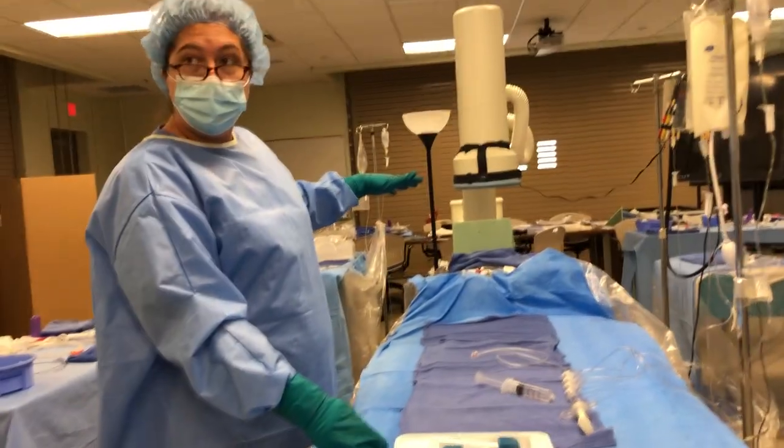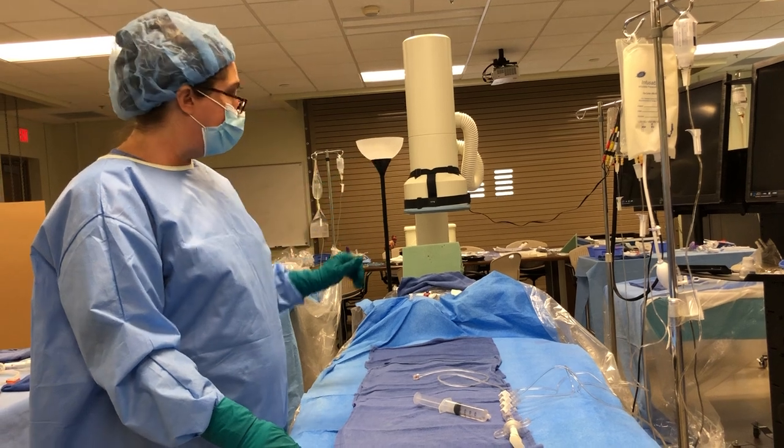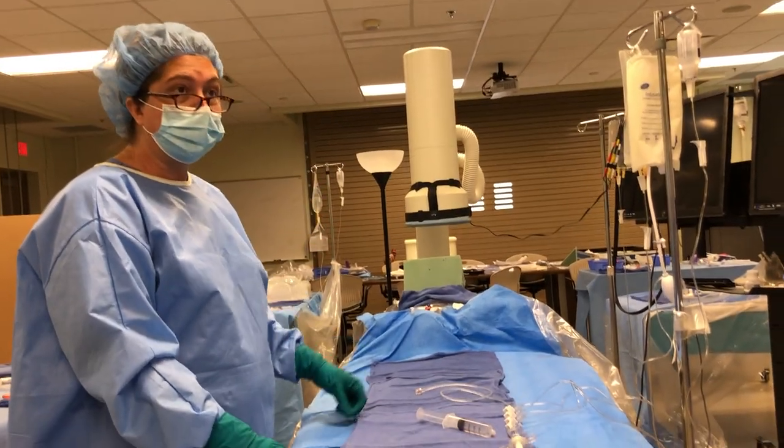The doctors called for the pericardiocentesis — we're going to do it. They've called for a stat echo; echo's gotten in here. We're probably going to be getting them prepped before echo even rolls in the door.